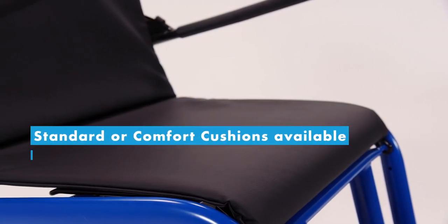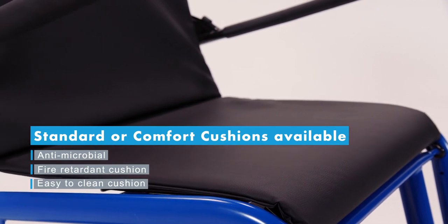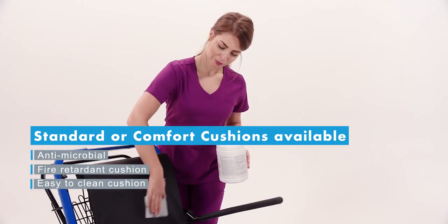The antimicrobial PU coated fire-retardant cushion fits perfectly to the bucket-style seat for enhanced safety and comfort. And they're really easy to clean.